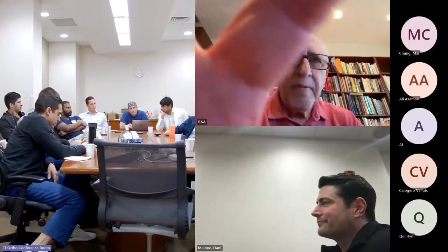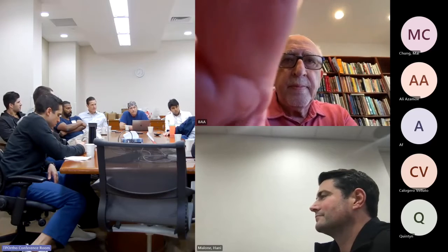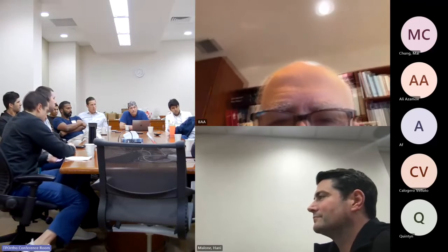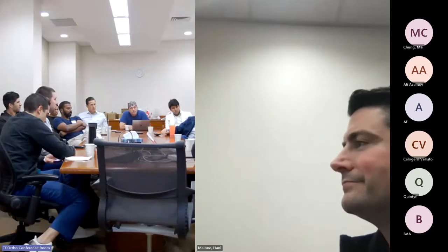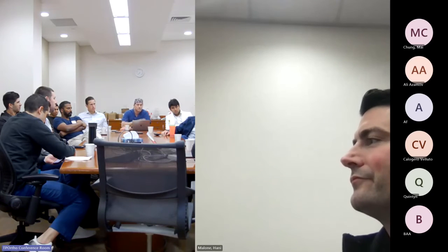In terms of graft selection, I've done a yo-yo. When I first started, I was using the expandable TLX pretty much religiously, and they all subside. That's the one I showed. So I moved towards using a static cage, a rotating banana static cage to put up front, but it's technically very demanding to do that through an MIS TLIF corridor.